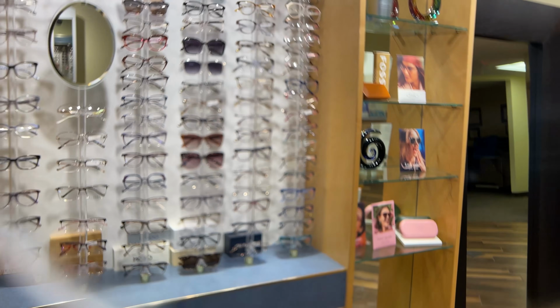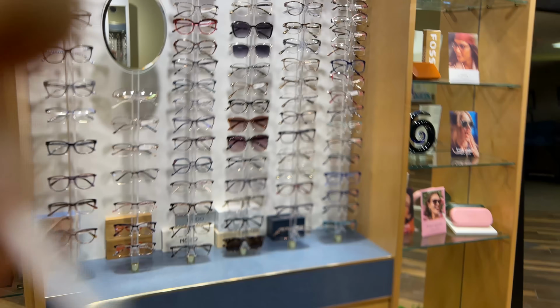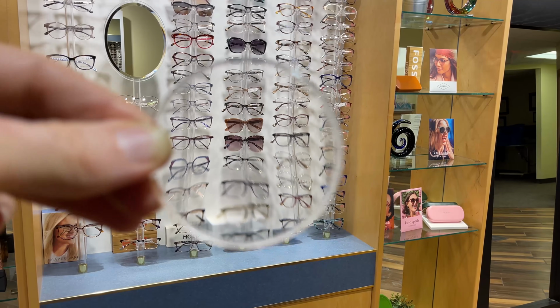Hopefully not, but that's a consistent amount of time I hear experienced opticians say it can take up to about 2 weeks to fully get used to it. But I've had some of my patients even say that, yeah, they first wore them, it felt really strange for a few days, and all of a sudden, boom, their brain snapped into it and it felt much more comfortable.